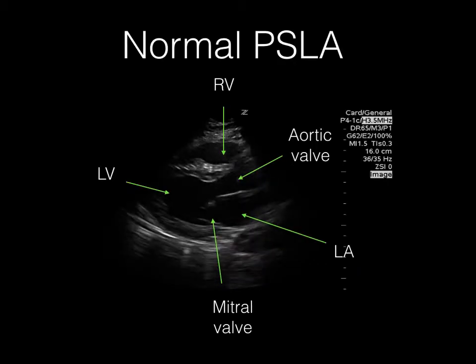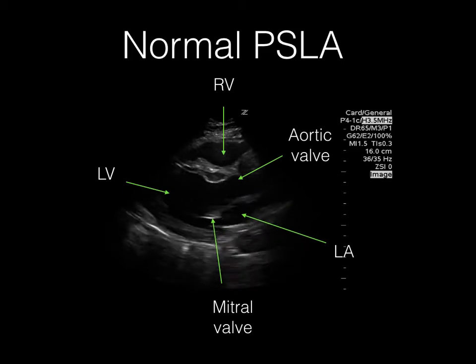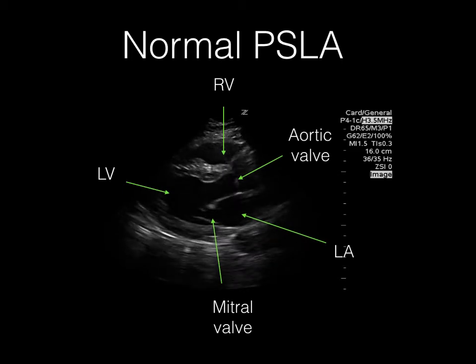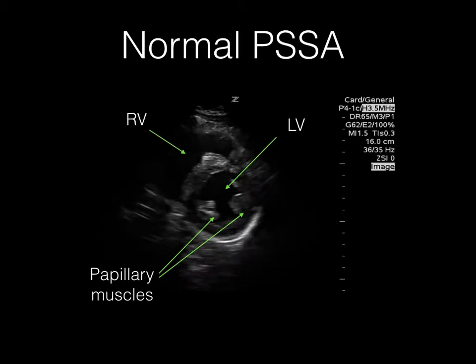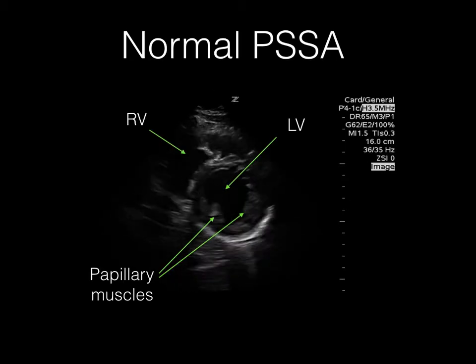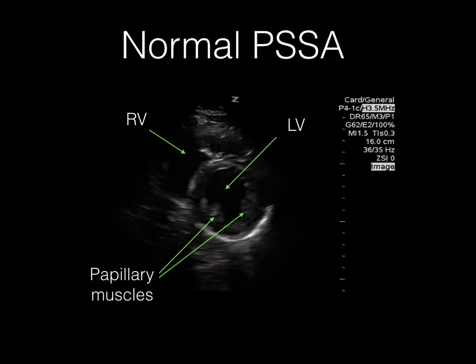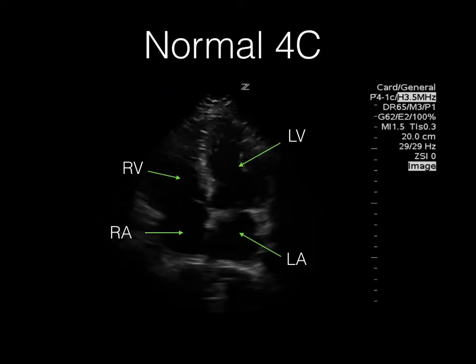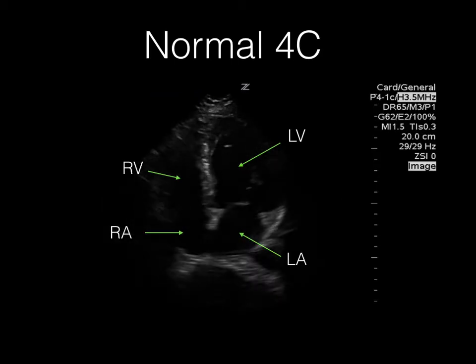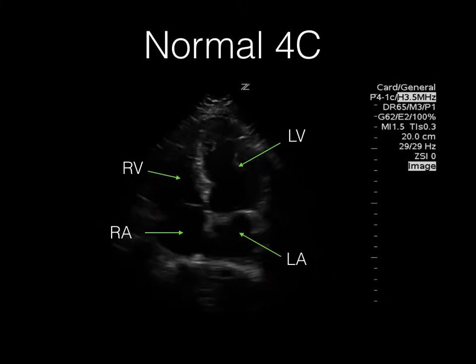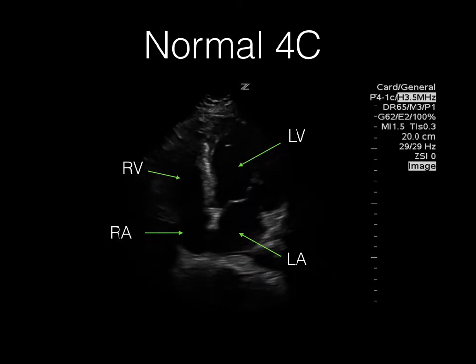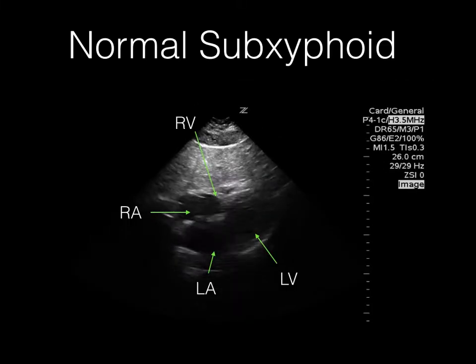We will review what images we expect to have with a normal heart. We can see here a normal parasternal long axis view. Here is a normal parasternal short axis view showing good left ventricular systolic contraction. We now see a normal four chambers view and a normal subcostal view as well.